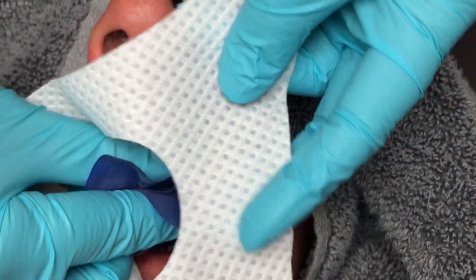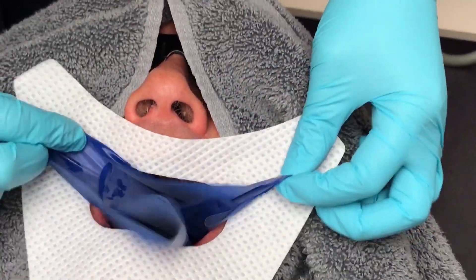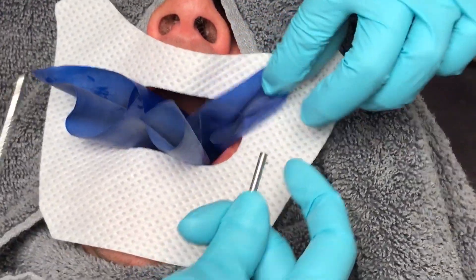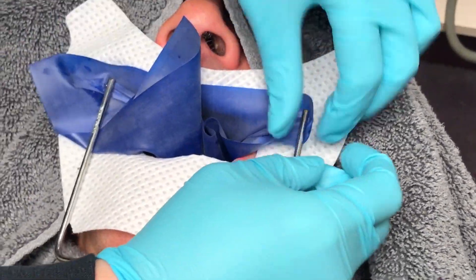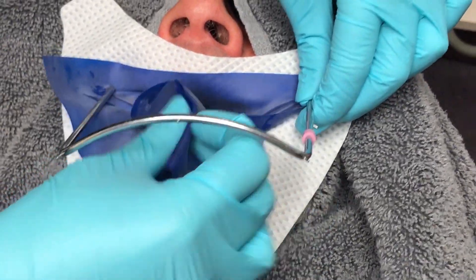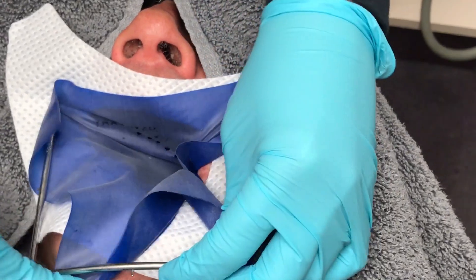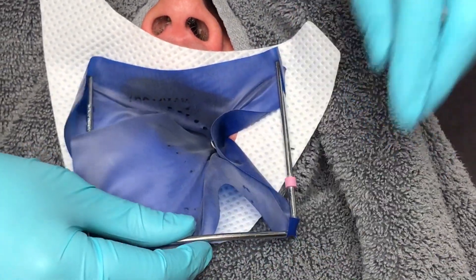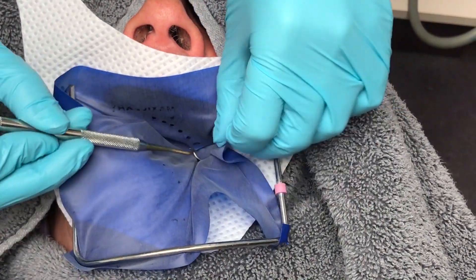I then place a white dental dam napkin on the patient, pulling the corners of the dam through the hole of the napkin and then over it. The napkin is used to protect the patient from any moisture that could ensue during the procedure. Once the napkin is in place, the frame of the dam is brought in to grab the top two corners of the dam first and then the bottom two next, being careful not to pull the dam too tight.